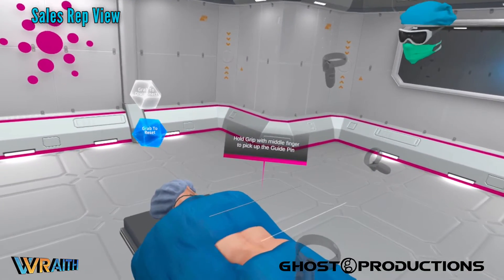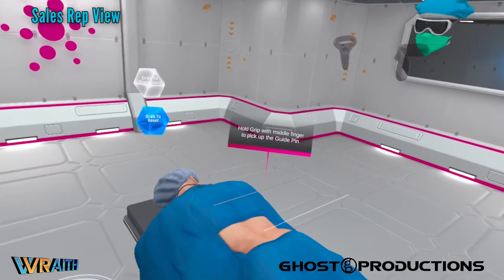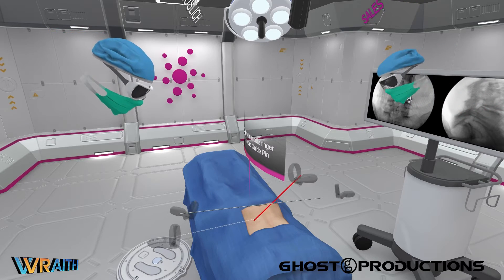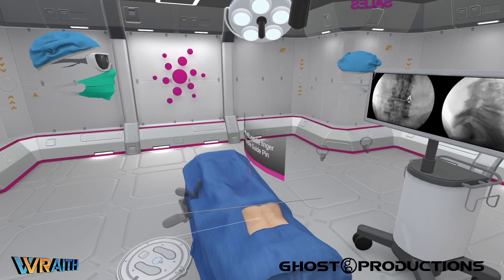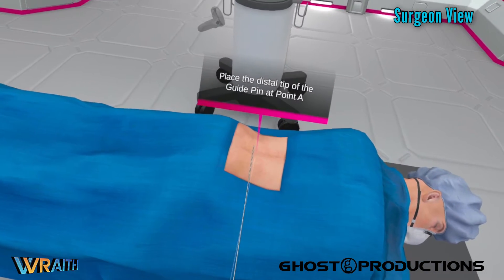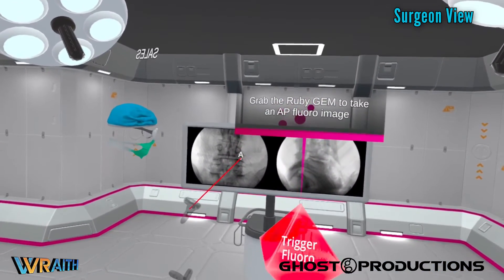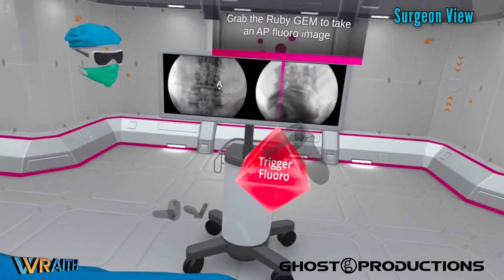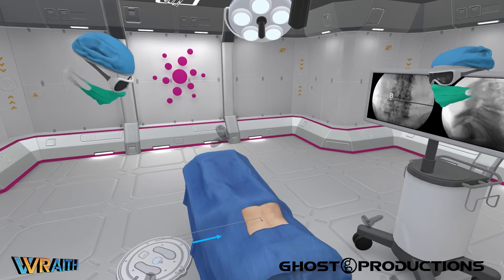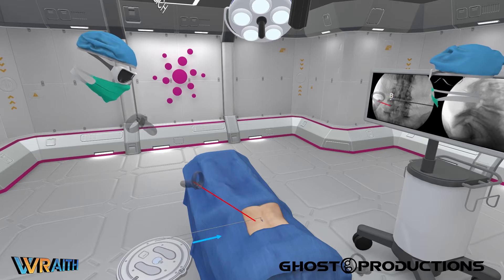The first part we'll go through is planning our incision, and we're going to do that through a couple of steps. The first is to find the ipsilateral margin of the spine to show you on the skin where we would typically make our first attempt at finding that point. Here you can see we've placed a spot on the fluoro where it would be. You can initiate a fluoro and take a look at where that ended up. The tip of the guide wire is at the ipsilateral margin of the spine at the disc space.